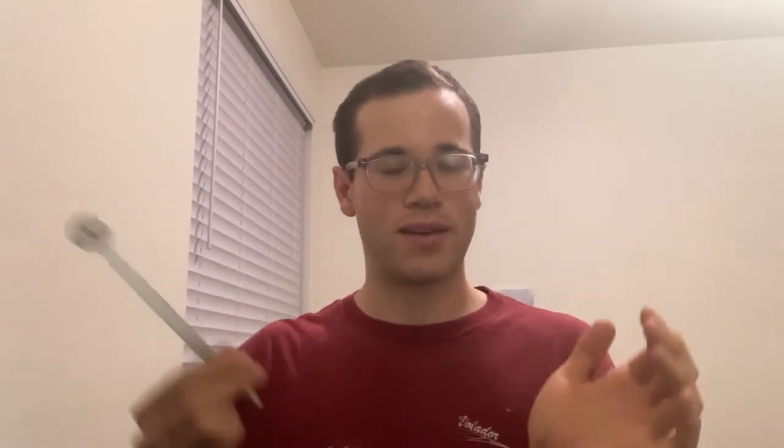After the Rinne test — checking whether it was positive or negative on both ears — you move on to the Weber test, which tells you whether or not you have sensorineural hearing loss on one or both sides. You take your tuning fork again, hit it, and place it on top of the patient's skull. In a normal patient without hearing loss, they'll tell you the sound is the same on both sides, because the sound waves travel equally down both sides, sending equally strong signals from both cochlea to the brain. If the patient says it sounds louder on the right side than the left, that would lead you to suspect issues with the sensory neuron — specifically the cochlea — in the left ear.